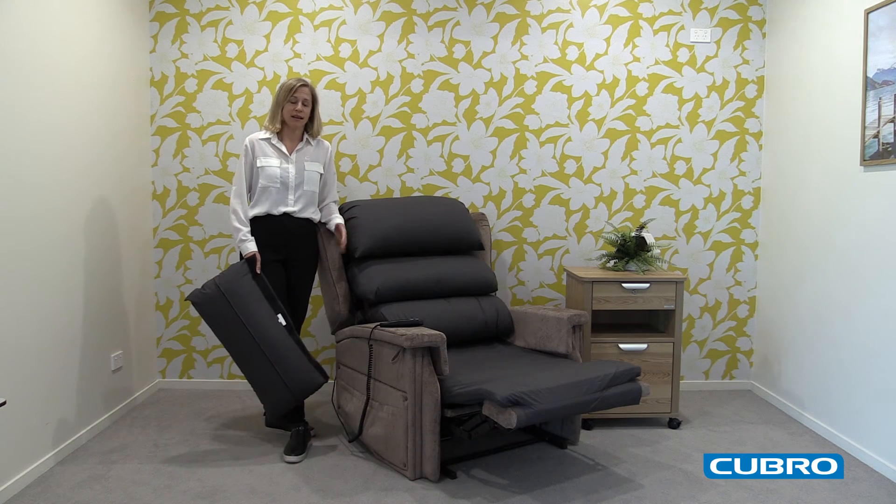There are a number of options to configure the chair to suit your client's needs, including seat depth and seat width. And obviously for people that aren't that mobile anymore, it rises to help them with mobility. If you've got any more questions, please do get in touch.